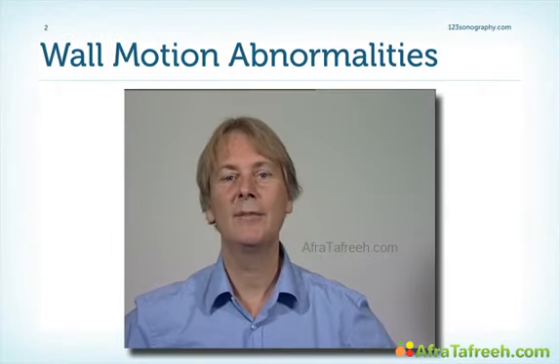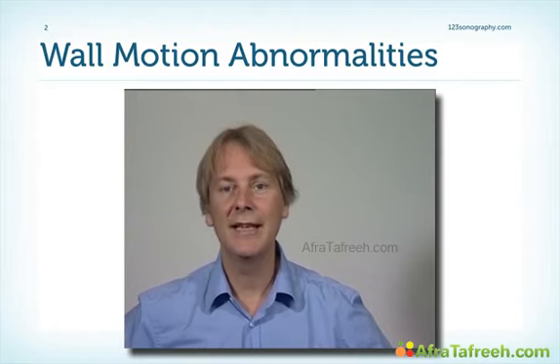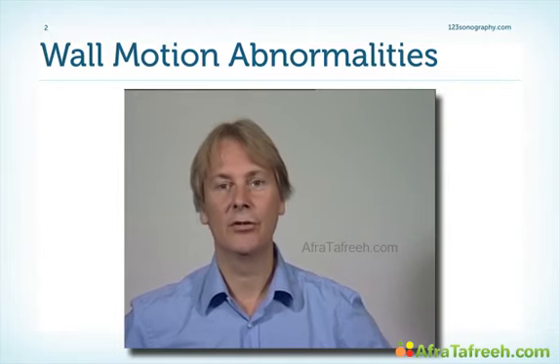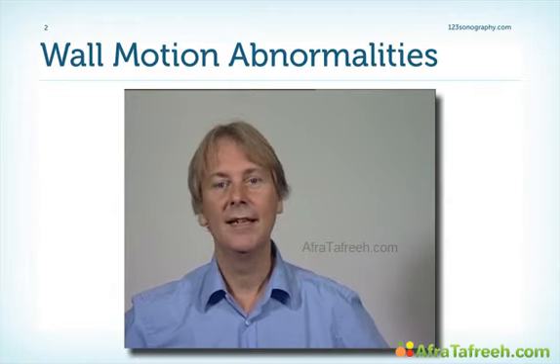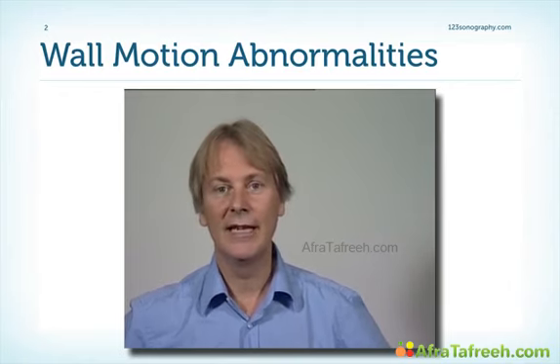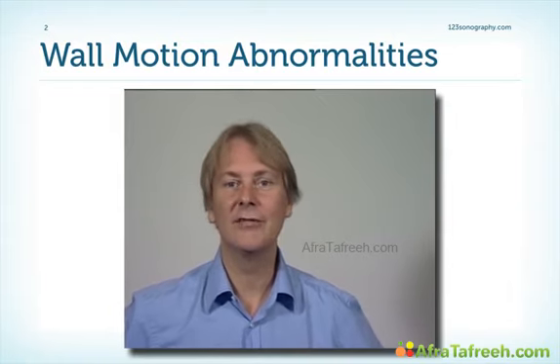I still remember way at the beginning of my time in echocardiography, when I was still learning, I was always attending my professor when he was reviewing studies. And he would be doing that from a video recording. You know, at that time we did not have digital echocardiography. And he would be sitting there and doing these studies in fast forward mode. And he would make diagnoses like hypokinesia or akinesia in even small segments.